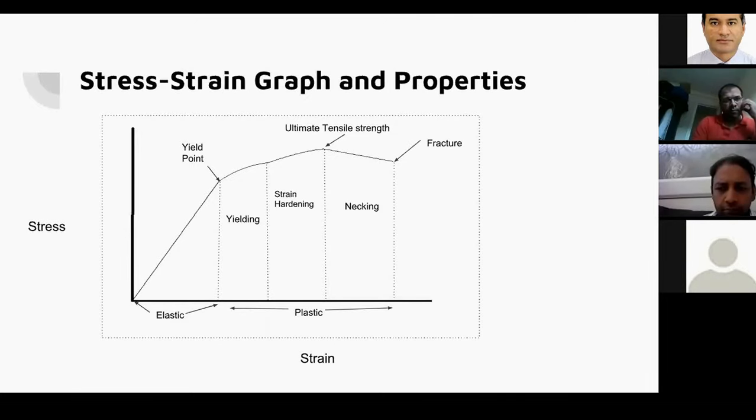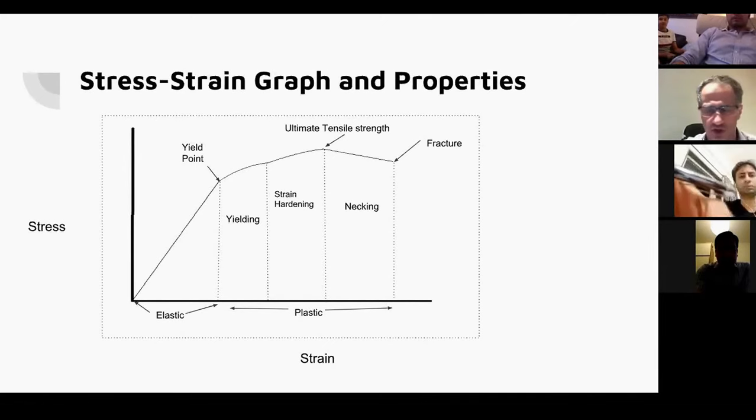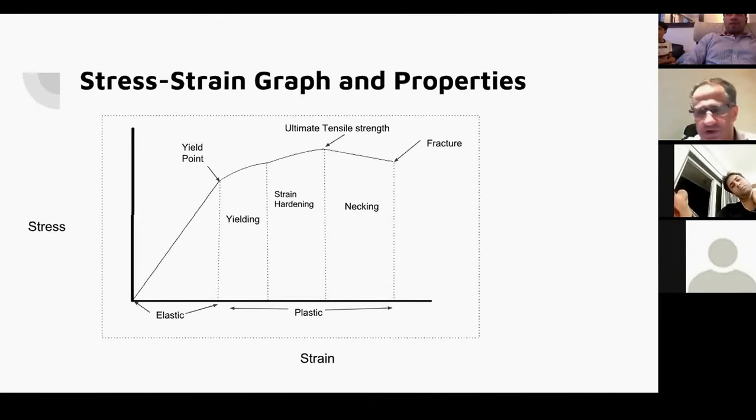Now, so far we've talked about the stress-strain graph and its modality and use in orthopedics and trauma. We've also talked about the different metals we use, and we've shown we know something about them and why we use different ones. You can even go through the advantages and disadvantages graph in Ramachandran's book, and you'll find that you'll be on safe ground straight away.